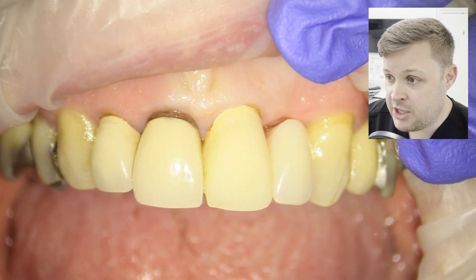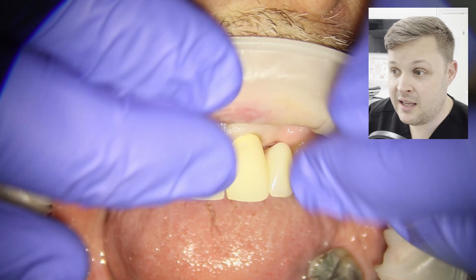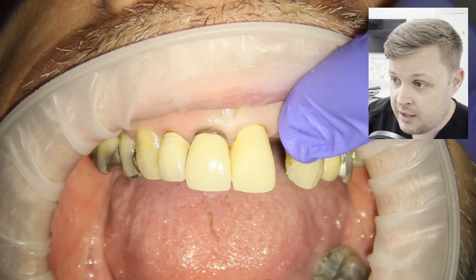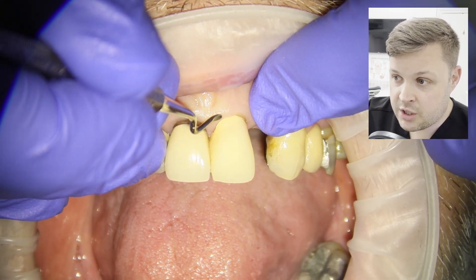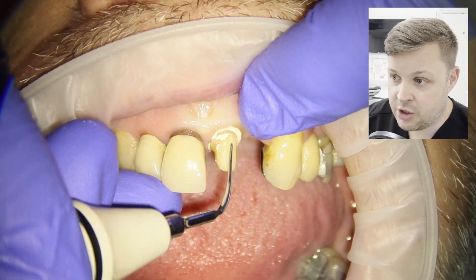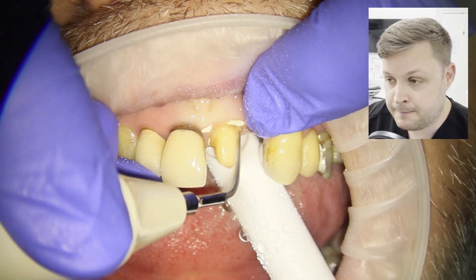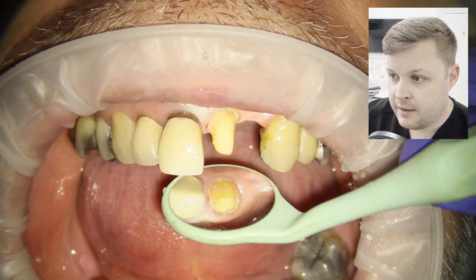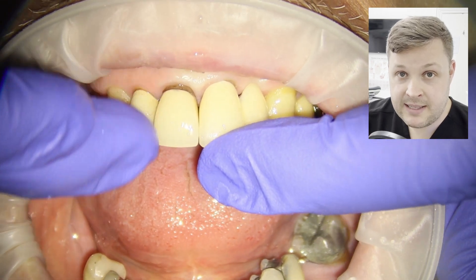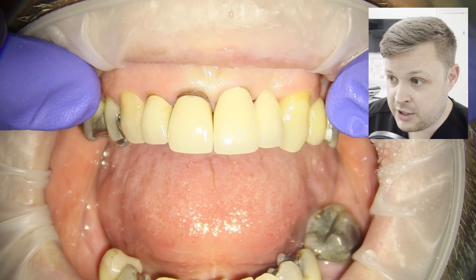Two weeks later the patient comes back. We inspect the temporary — it hasn't stained, the gingiva has grown over it nicely, and it looks pretty good. We remove the denture, then slowly jimmy off the temporary crown — it comes off perfectly. Then we clean the prep up with an ultrasonic tip, being careful not to catch the gum, as that would affect the fitting or cementation of the final crown.